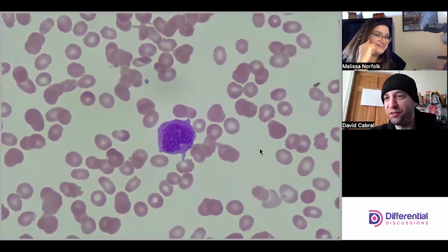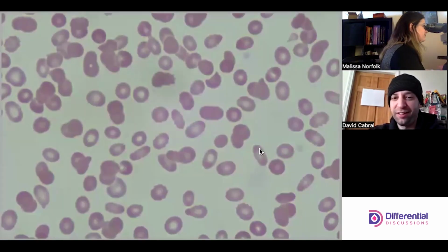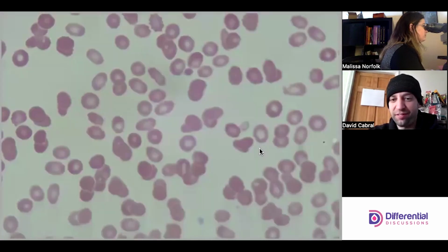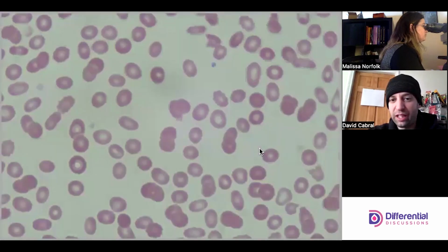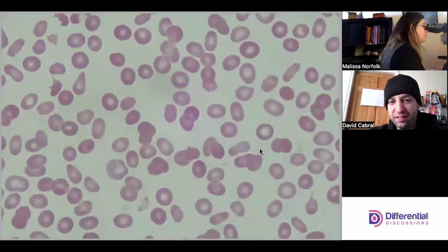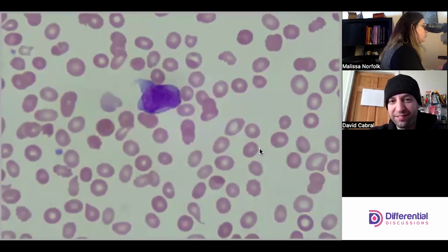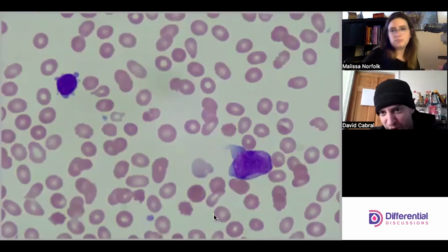Right? So these are the confusing elements that are fighting each other. The struggles of a low white count and a lymph. Yeah, but this slide is mostly lymph. An abnormal cell. Yep. Lymph. Ooh, perfect. Perfect.